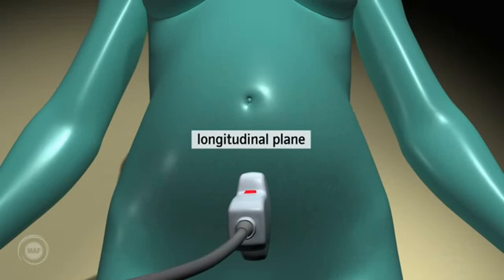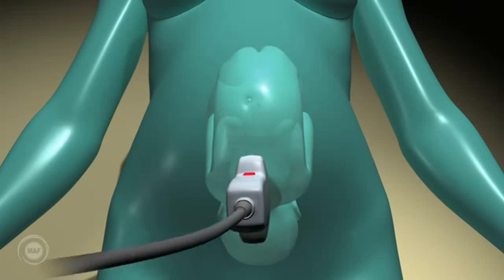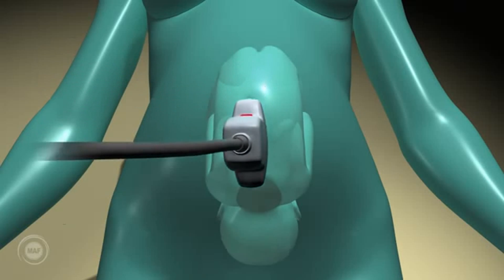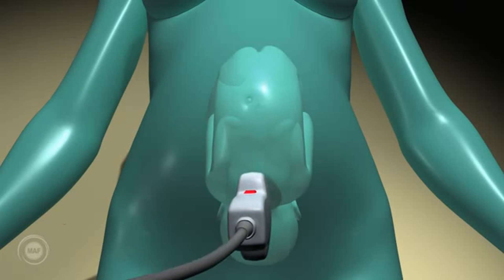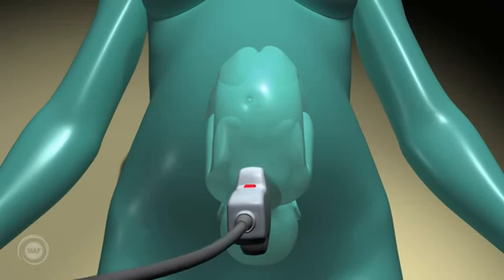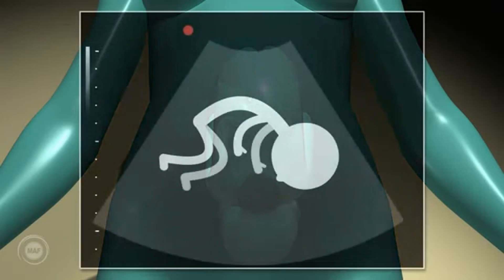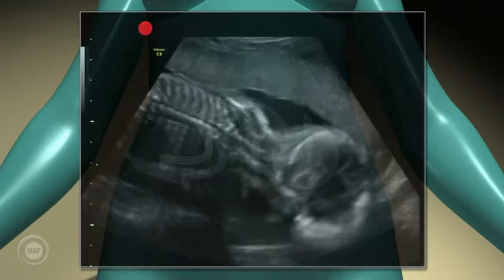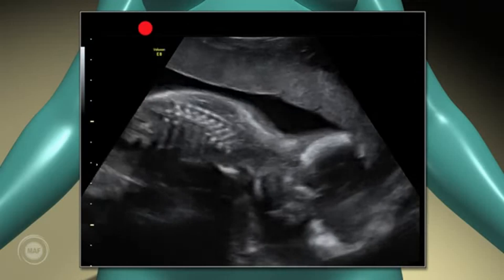Back anterior. Scanning in the longitudinal plane, the fetus' spine will be lying just under the mother's abdominal wall. The head will be to the right of the screen and the fetus' back will lie at the top of the screen.